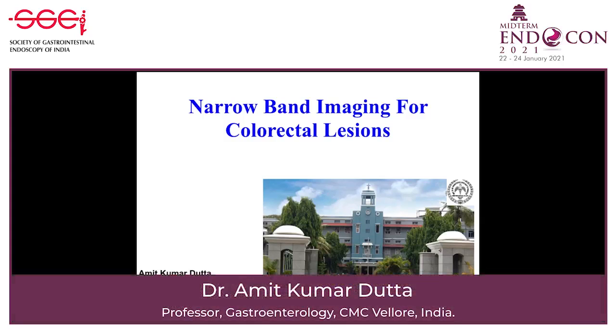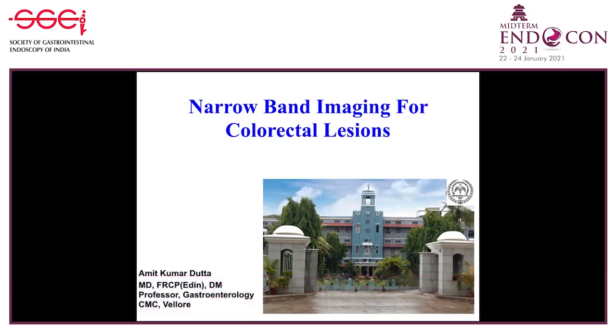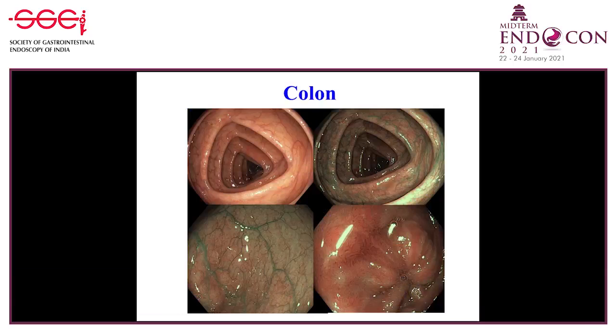The topic of my presentation is narrowband imaging for colorectal lesions. Narrowband imaging is a type of image-enhanced endoscopy which enables us to see the mucosal surface in greater detail and helps in identifying early lesions as well as predicting the nature of lesions in real time.